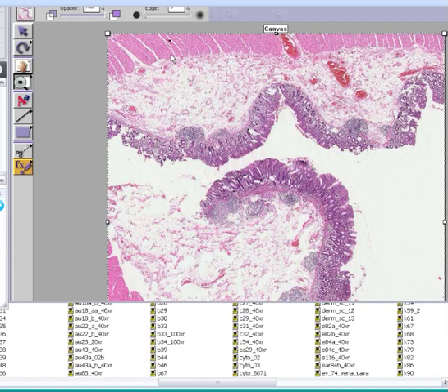So this is what we call the moment of truth. Let's really think about what we just saw. What we saw is a slide of a colon in which there appear to be inflammatory changes within the mucosa, but they're limited to the mucosa primarily, and there's ulceration, and we saw a crypt abscess. Well, we know it's not cancer because we don't see any glandular proliferations.